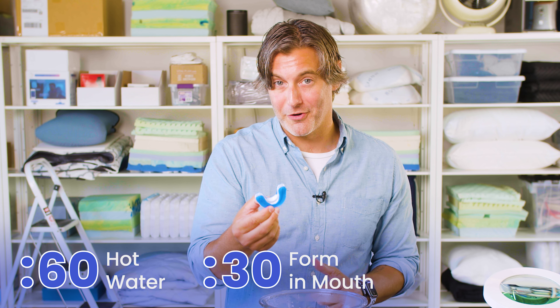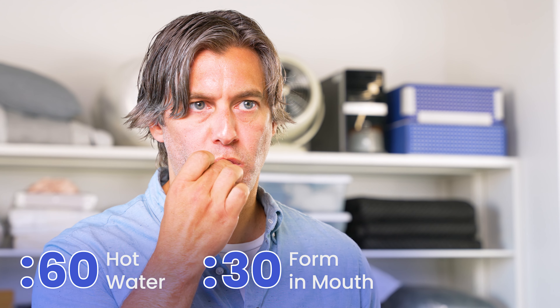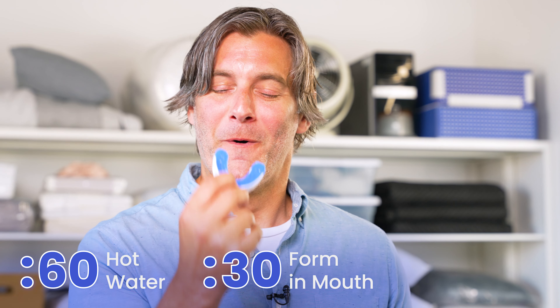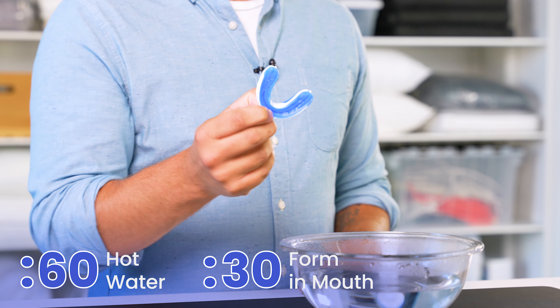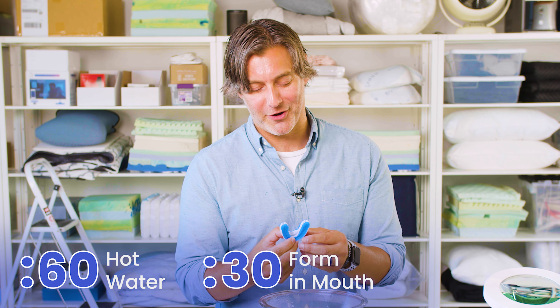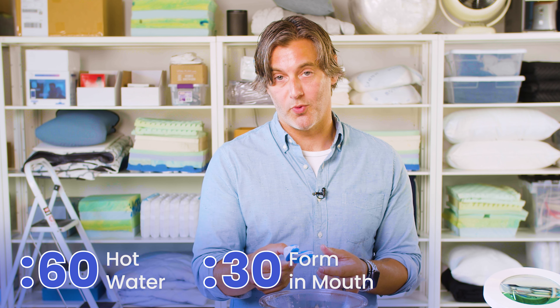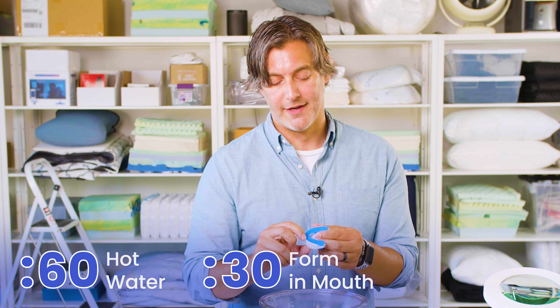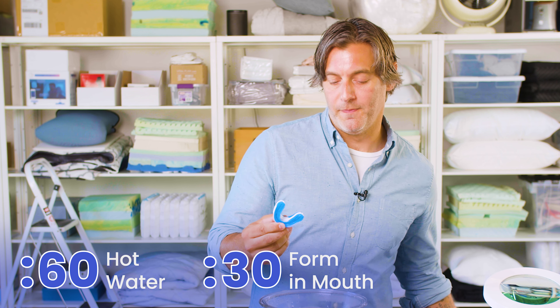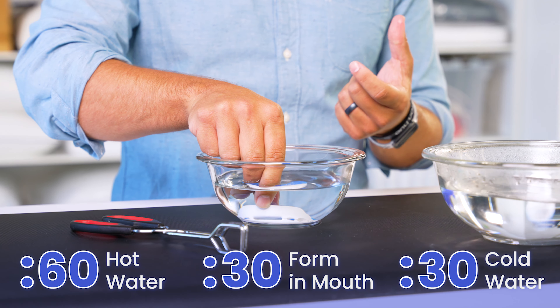So we'll cool it off, and then we're just going to place it in our mouth for about 30 seconds to form this thermoplastic material around our teeth. So after about 30 seconds, you can take it out, and it has grooved to my teeth, as you can see. It kind of reminds me of actually playing football as a kid, getting the mouth guard set in your mouth. If you feel like the impression is good and it works for you, you can then grab a bowl of cold water and dunk your mouthpiece for 30 seconds to allow that impression to set.